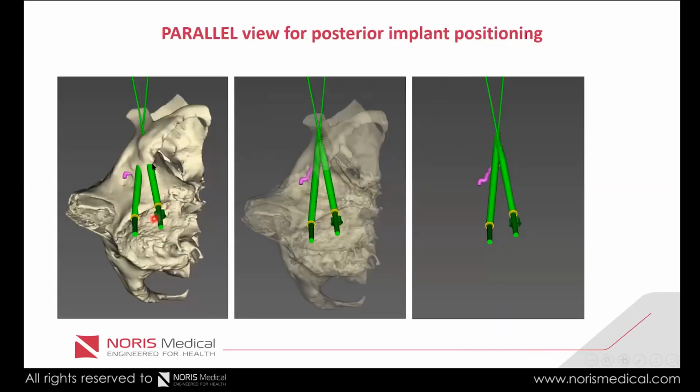Okay, so this is the view we're having. In this view, we see the implants one on top of the other, and basically this is the implant. But are they touching right now? How could we know if these implants are actually touching one another? From this view, we cannot know. But there is a view that we will know.